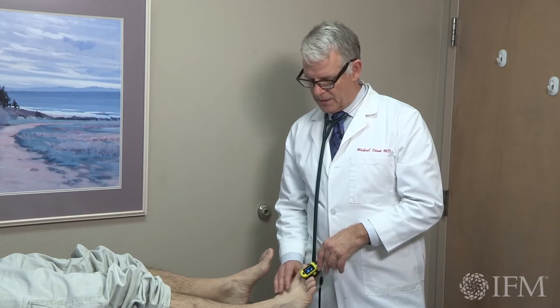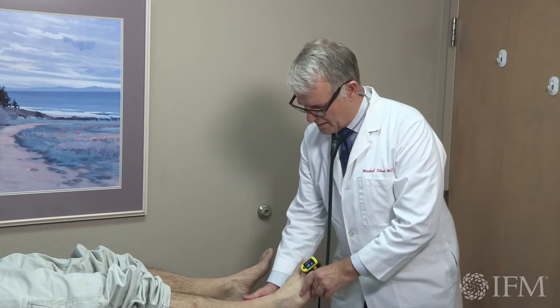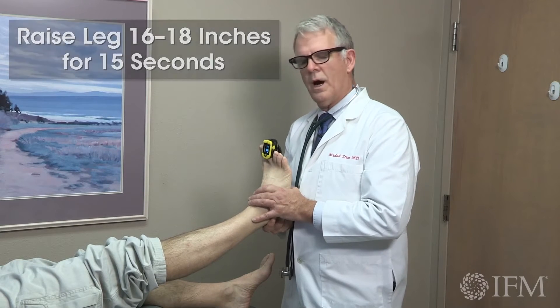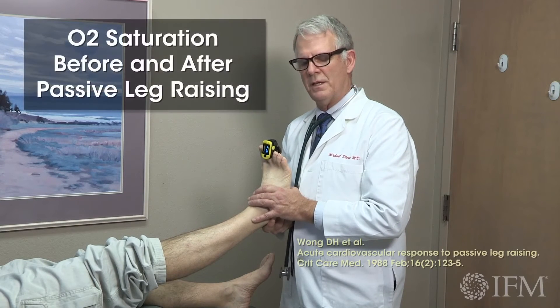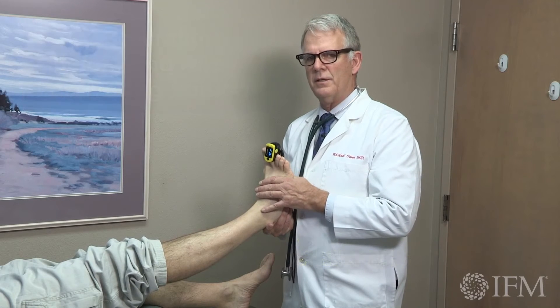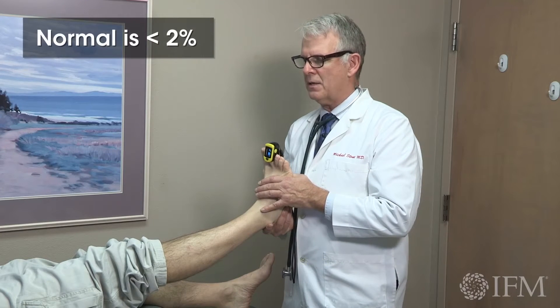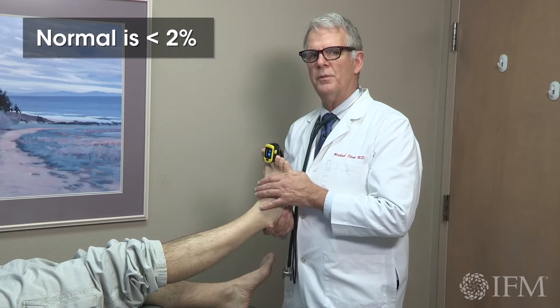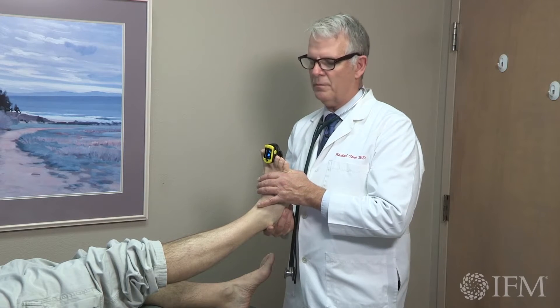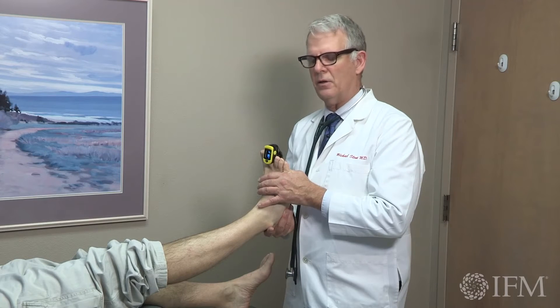The reason we do this test is because when you raise the leg 16 to 18 inches off the ground and watch the oxygen saturation for 15 seconds, if it stays stable and does not drop greater than 2%, then it has a greater likelihood ratio of predicting greater sensitivity and specificity of predicting peripheral vascular disease than the ankle-arm index.